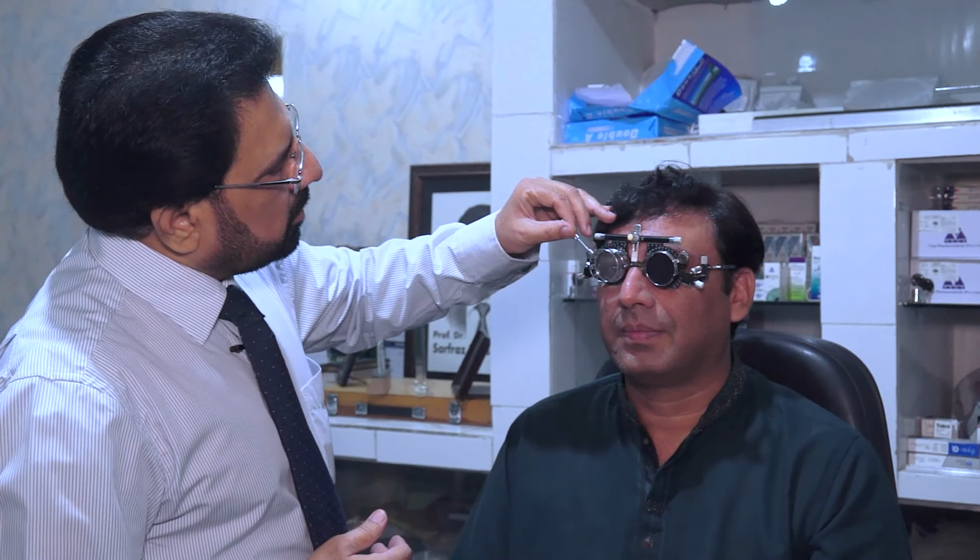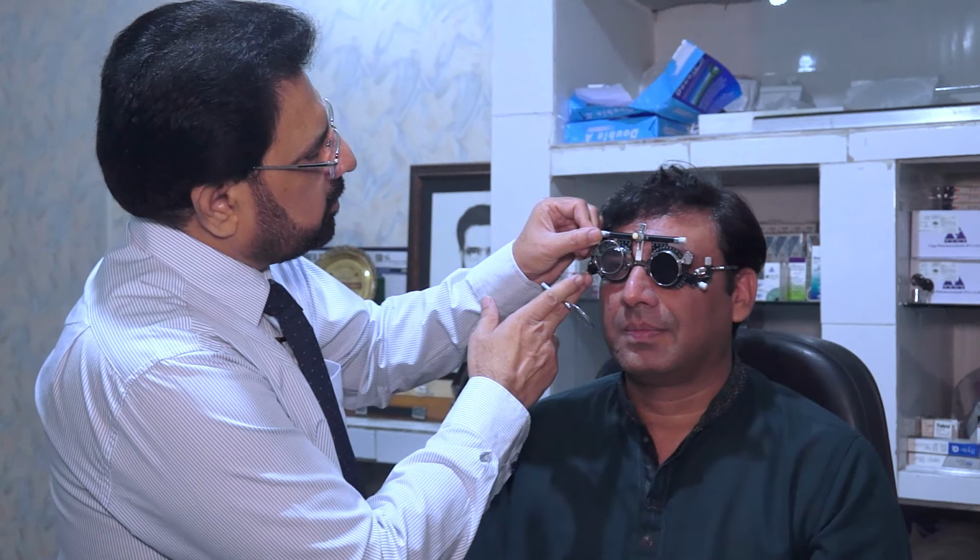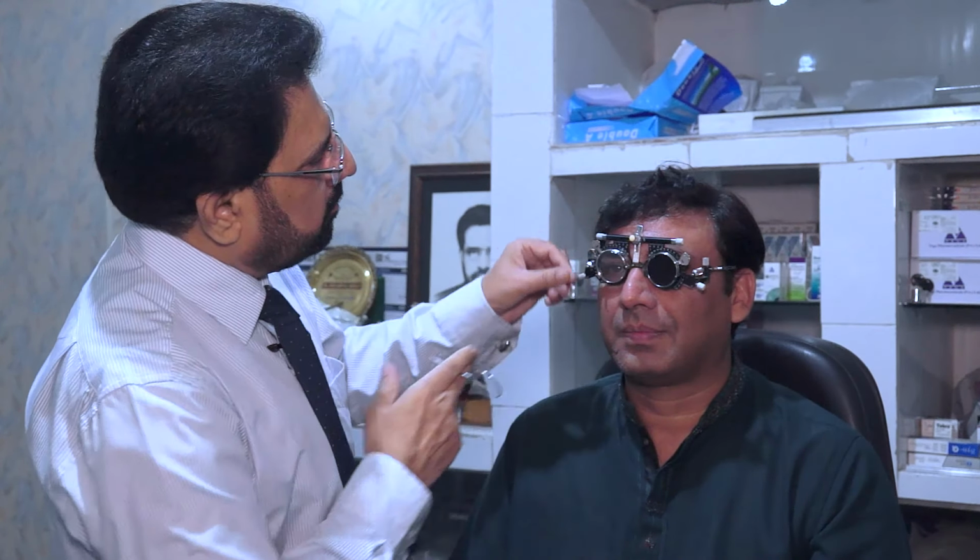So now we are going to check the power of the lens. Is this one better? This one better. Okay, so we're going to change the power. We are going to reduce the cylindrical power. This one is better than the previous one? Okay, can you now tell me again, please?